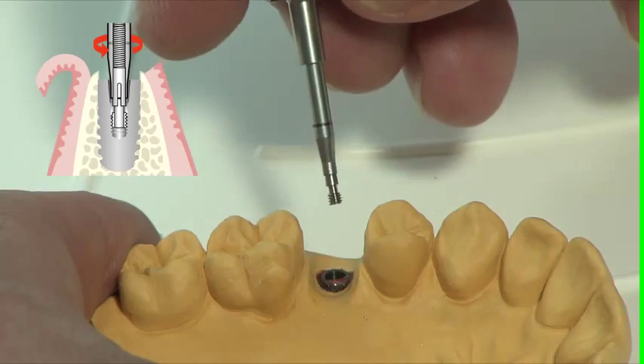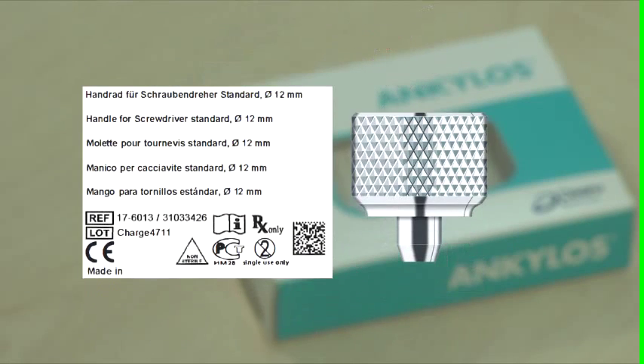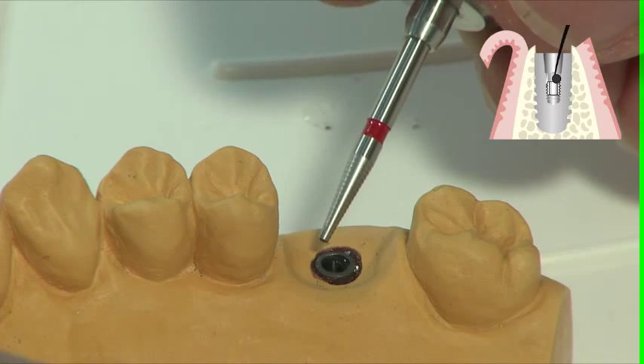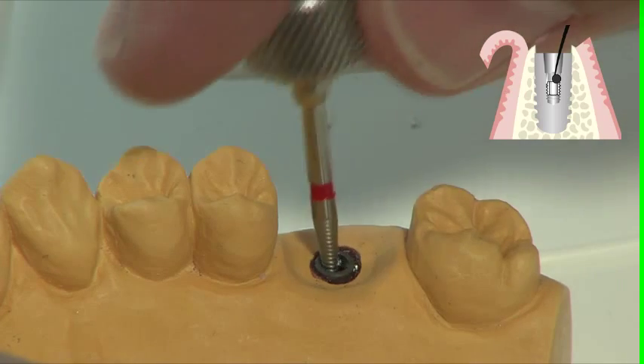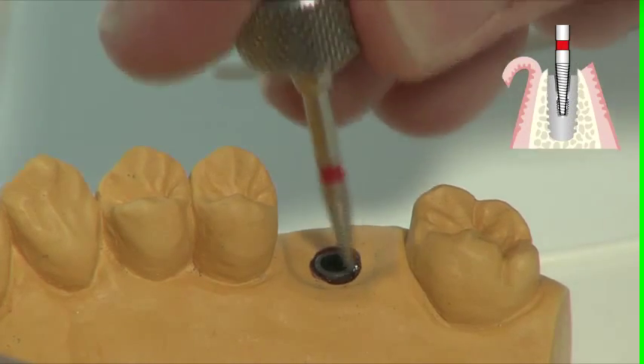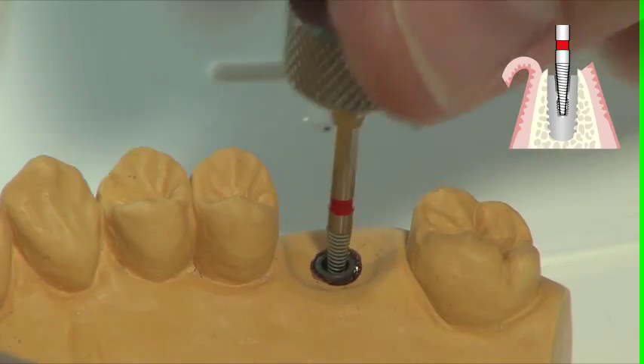If only the threaded sleeve is located inside the implant, the unscrew instrument which is operated with the handle for the screwdriver insert should be used next. Locate the opening in the sleeve, push the instrument into this opening and turn counterclockwise.